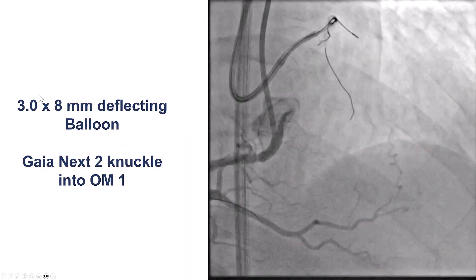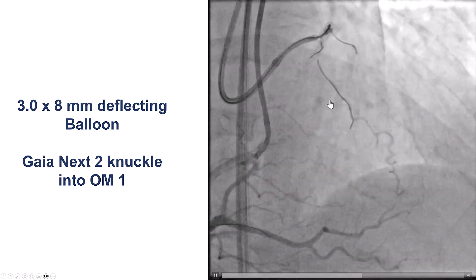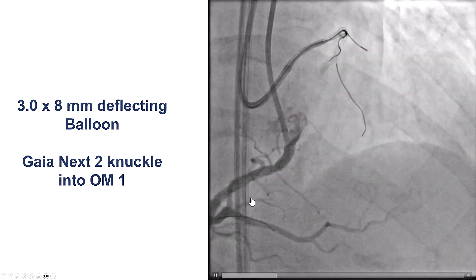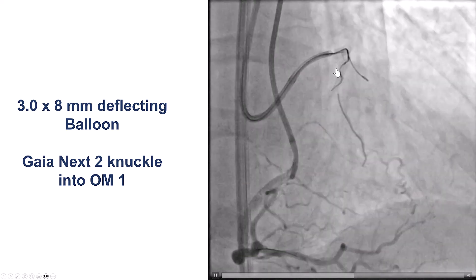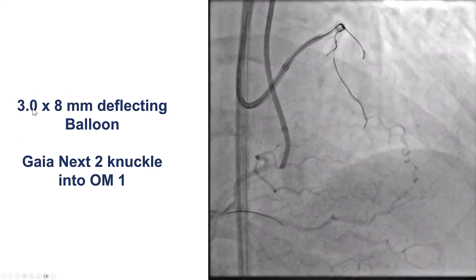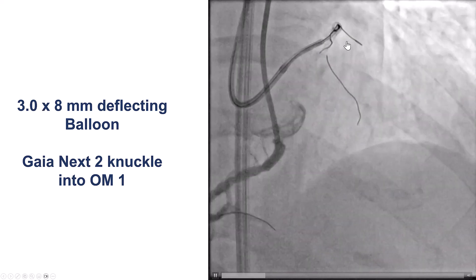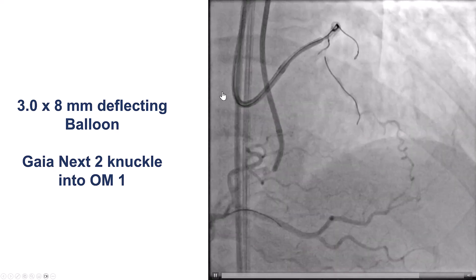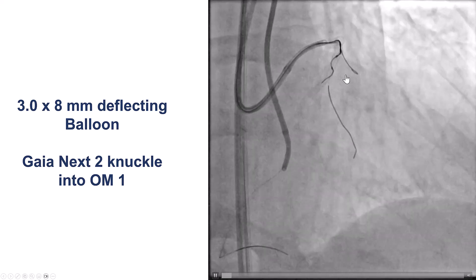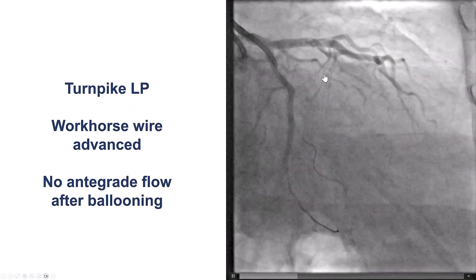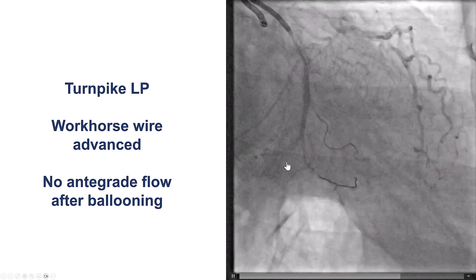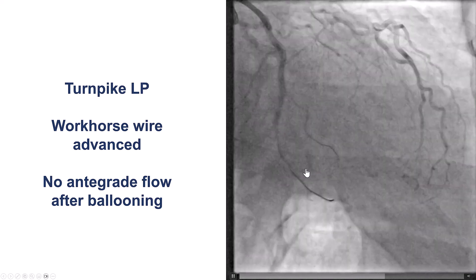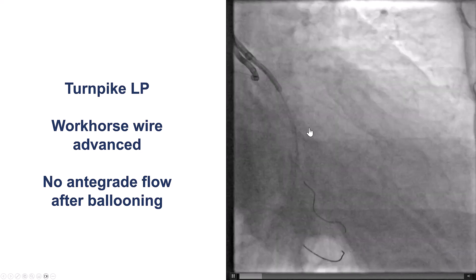We decided to use a small balloon past the presumed origin of the obtuse marginal branch. We inflated a 3 by 8 millimeter balloon just distal to where we thought was the origin of the obtuse marginal, and then tried with the Gaia Next, which actually knuckled and prolapsed into what seemed to be the first obtuse marginal branch. So now we had a wire in the second and in the first obtuse marginal branch, but even with balloon inflation, we didn't have real antegrade flow in that obtuse marginal branch.